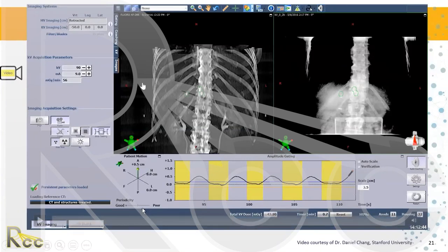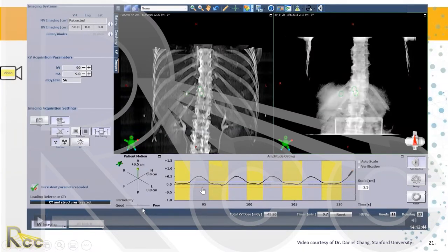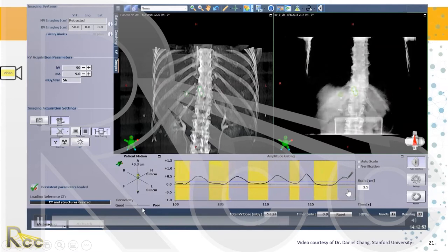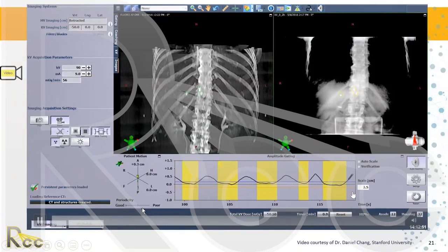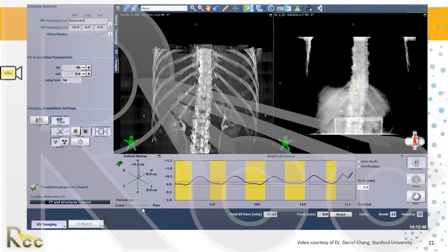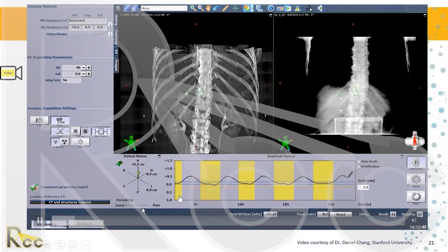Here's an example showing fiducials contoured in green. This is amplitude gating — we can see the inhalation and exhalation trace, and the blue and yellow threshold lines. When those fiducials line up to where it's been planned, the beam turns on. Yellow indicates beam on; white indicates beam off. The software is helping us turn the beam on when the patient's breathing is within range and off when it's outside of the desired threshold.